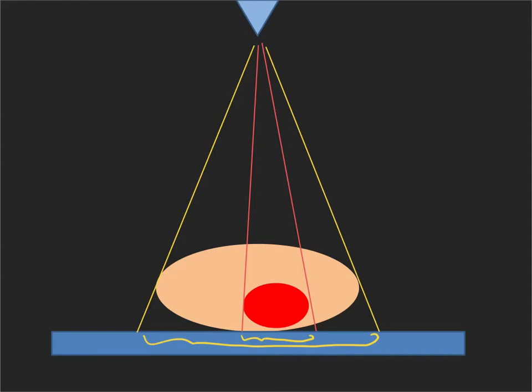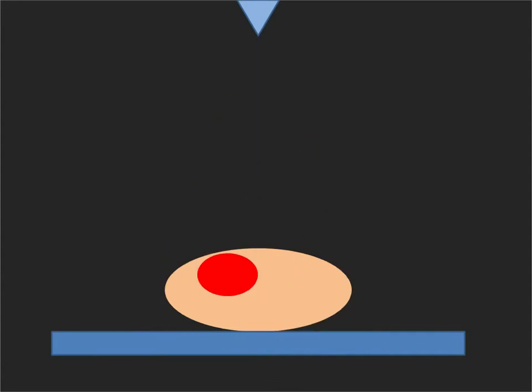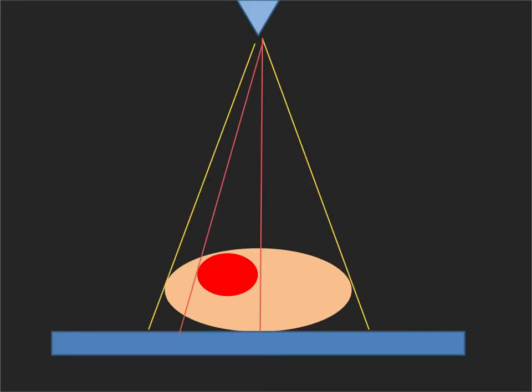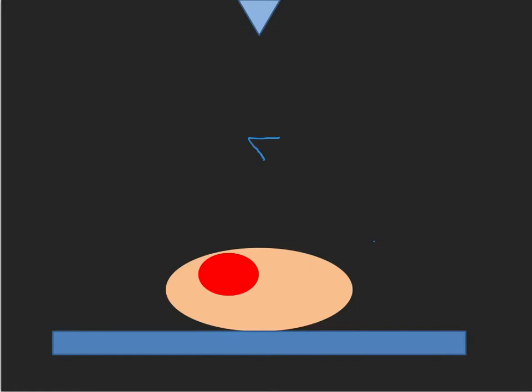Now let's compare that to an AP study. In the AP, the heart is anterior because the patient is facing the other direction. That ratio of heart projection to thorax projection is now significantly larger — the heart is just being falsely magnified. The closer the x-ray generator is to the patient — remember portable studies are done at 40 inches rather than 72 — the greater that magnification effect is going to be.